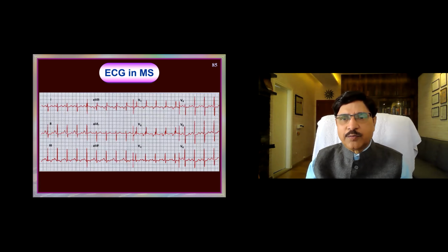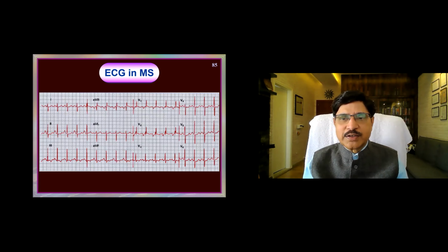Suppose you have added atrial fibrillation, then of course MS with atrial fibrillation. In that case, the P wave changes of hypertrophy will be missed. We will not see atrial hypertrophy. When there is atrial fibrillation, make it a point not to comment on atrial hypertrophy. If you say atrial fibrillation and also left atrium enlarged, that means something is wrong in the brain. Isn't it? So when there is atrial fibrillation, we are not able to see an atrial wave. Where is the question of left atrial hypertrophy or right atrial hypertrophy? Never say atrial fibrillation and also atrial involvement. It's not possible.